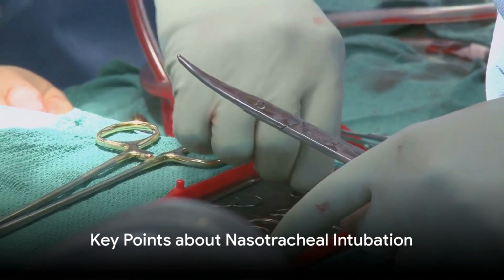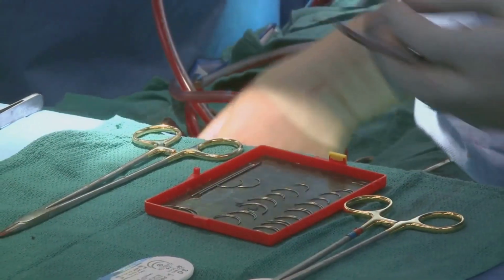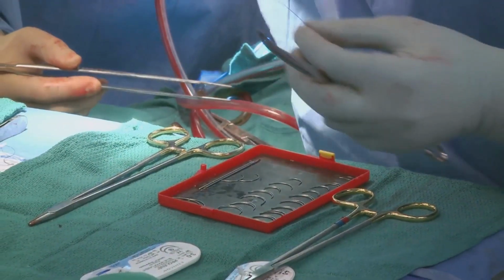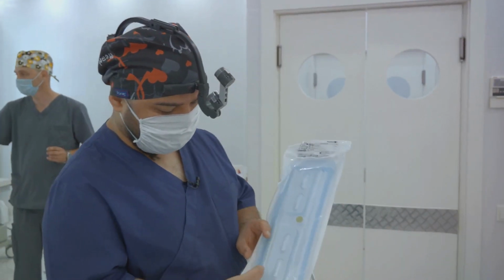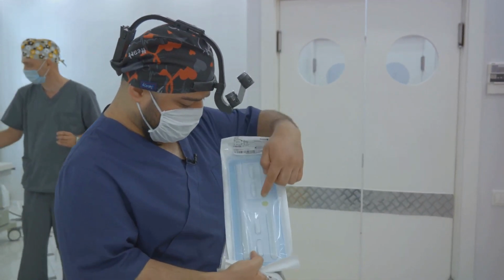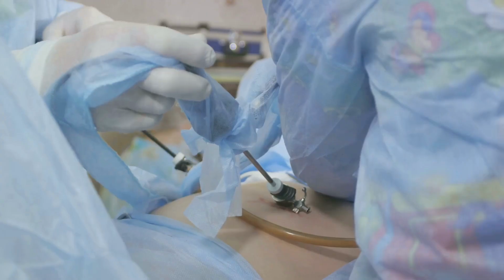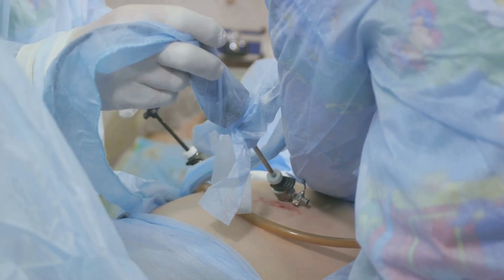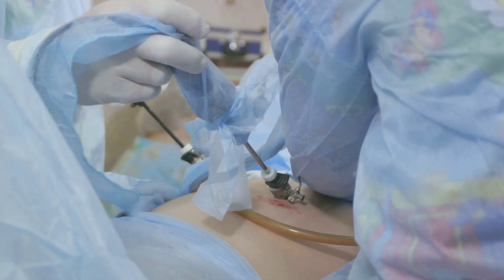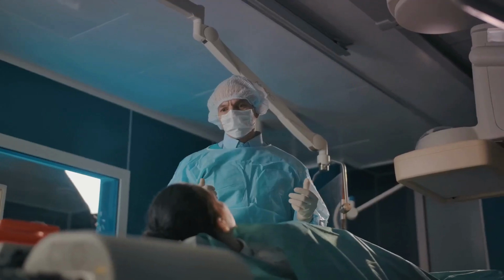Now that we've walked through the process, let's revisit some key points about nasotracheal intubation. Nasotracheal intubation, a crucial procedure in the world of anesthesiology, involves the insertion of an endotracheal tube through the nose and into the trachea. This technique is commonly used in situations where oral intubation is not feasible or preferred. We've discussed two primary methods for nasotracheal intubation: direct laryngoscopy and nasal fiber optic intubation.